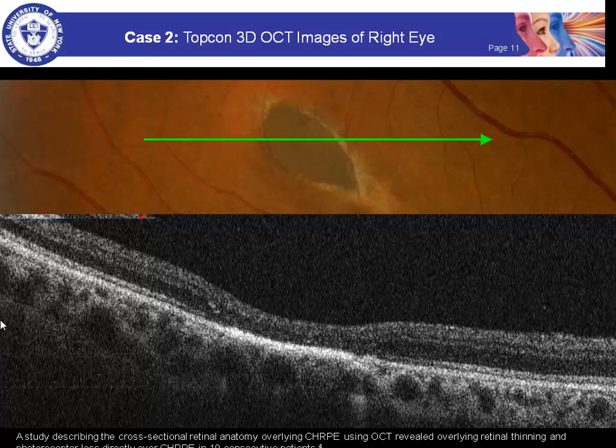Great. Another question here. The Plaquenil OCT screening tests, are they reimbursable? There's a code that you can use for Plaquenil toxicity workup, and that usually includes pretty much everything. In our office, I've never been told that it's been turned down. So I think Plaquenil toxicity testing will cover OCT. It certainly covers 10-degree fields, and it certainly covers fundus photography.